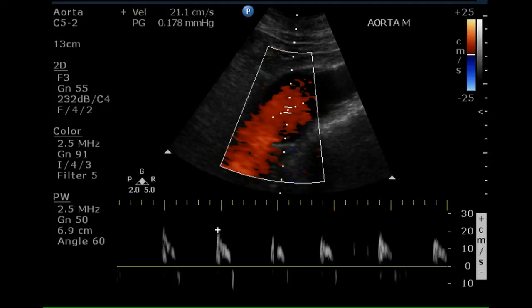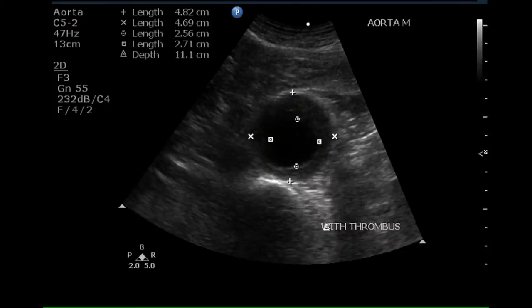The pulse Doppler waveform is high-resistant and this indicates we are below the level of the renals. No reverse flow is clearly seen and this is an abnormal signal. This is a transverse image of the middle portion of the aorta and the flow lumen and outer dimensions of the aneurysm have been measured.